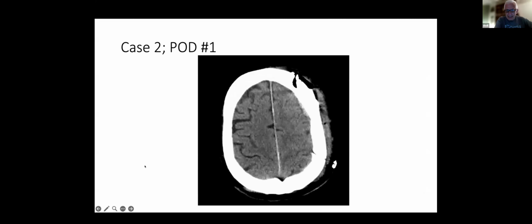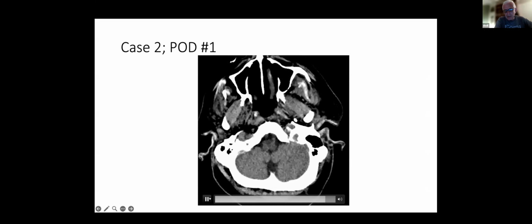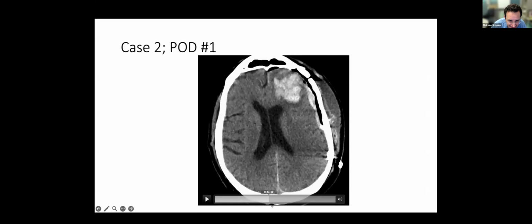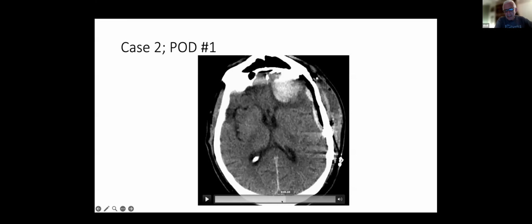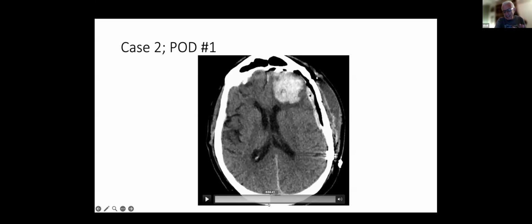So I'm asking if there is the possibility that this hemorrhage doesn't look like it comes from the ethmoidal fistula, no? These are six slabs, right? The hemorrhage is not centered at the bottom. Exactly. So it looks more like a venous hemorrhage. And also the first one looked that way to me in the other case. So I'm not so sure there was a remnant of the fistula.